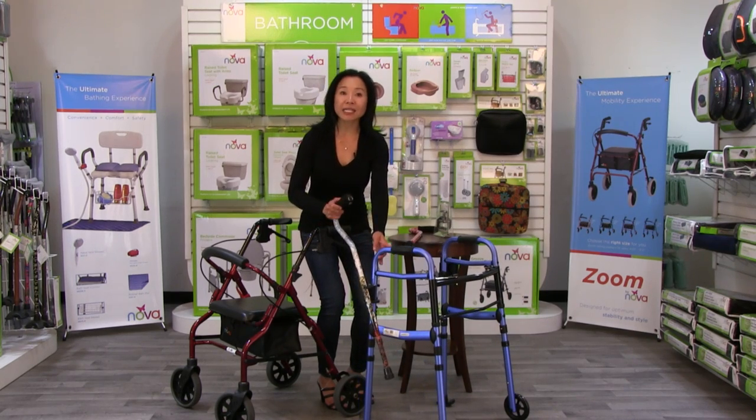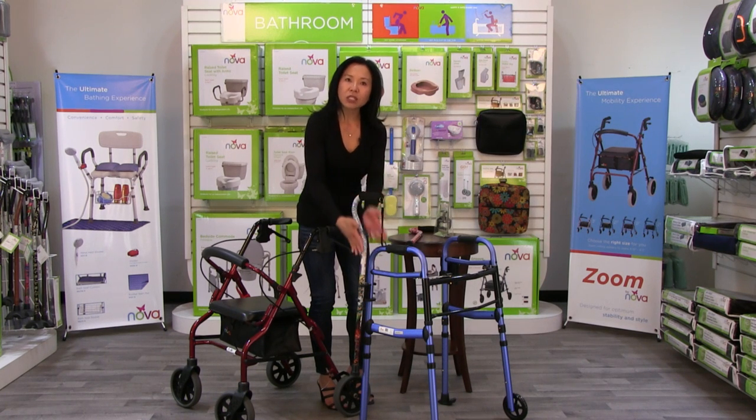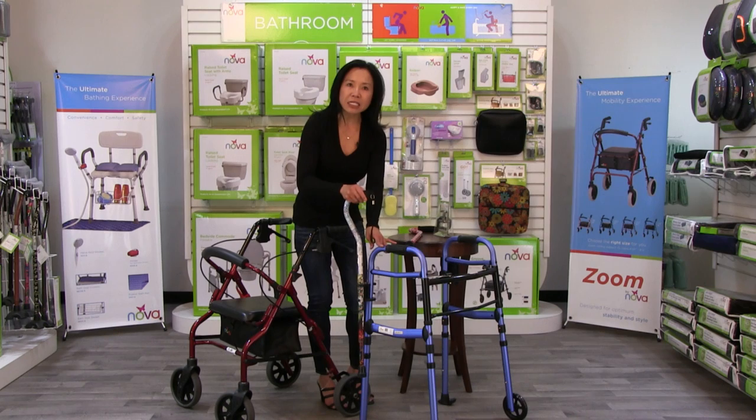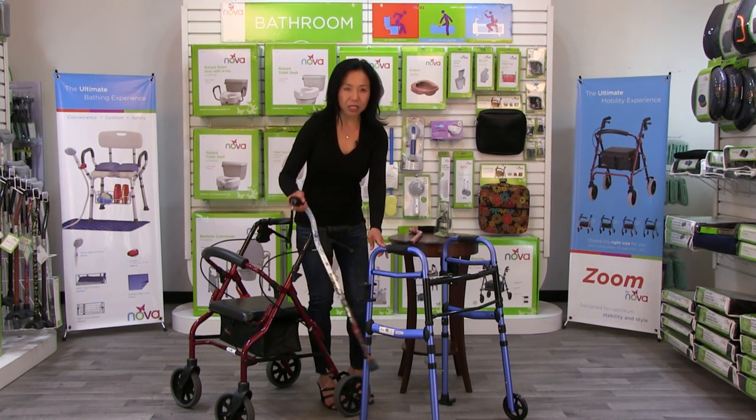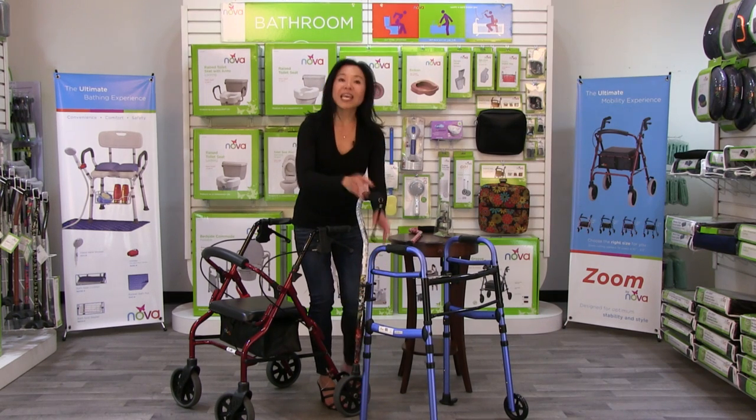This cane holder gives your cane a home. When you're not using the cane, it attaches to this clamp here and keeps it streamlined. Then when you need to use the cane, it's so easy to unlodge it, use the cane, and then put it back.